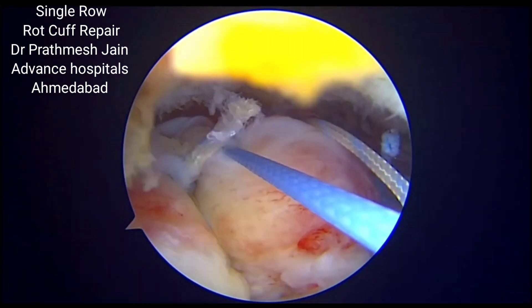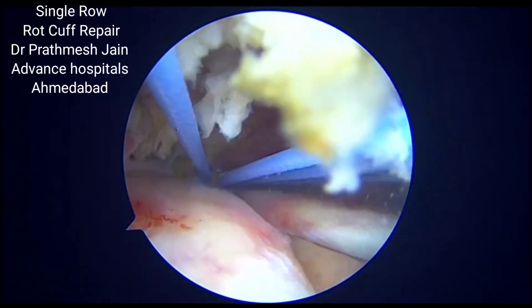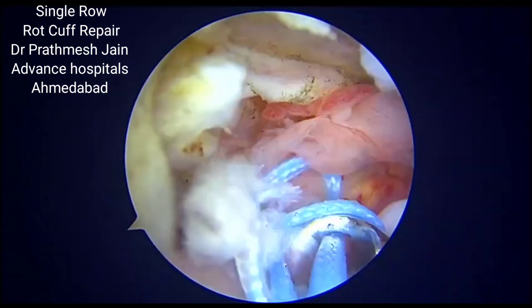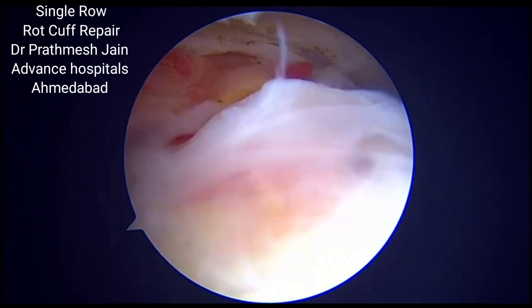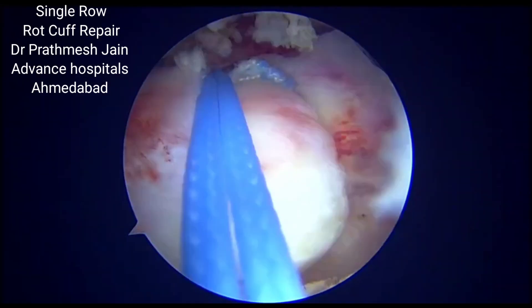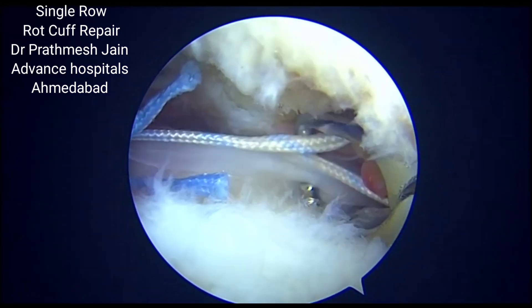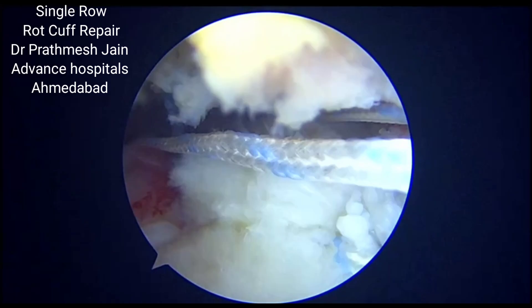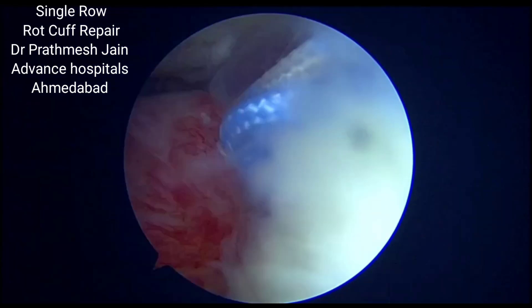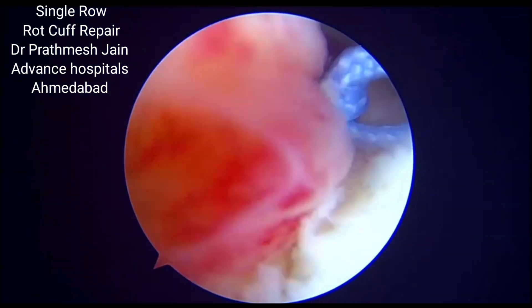This is a simple low cost technique of rotator cuff repair, particularly useful for beginners who don't want to struggle much with suture management. It is a low cost, low profile technique because you will need fewer suture anchors, and the repair quality in these medium size full thickness supraspinatus tears is good with very good eventual healing. A very important tip is not to miss the inferior lamina, because if you miss it you will not get the desired power of the rotator cuff at the time of final healing.